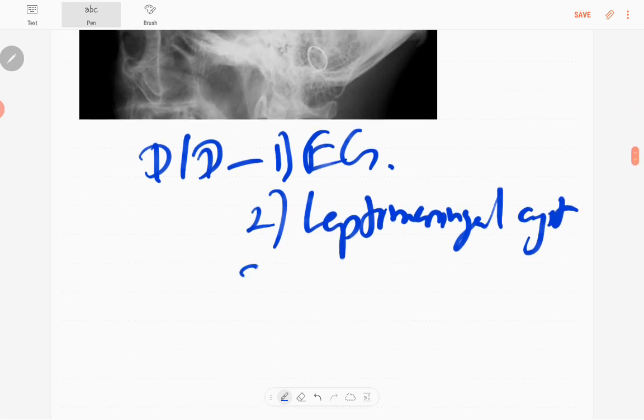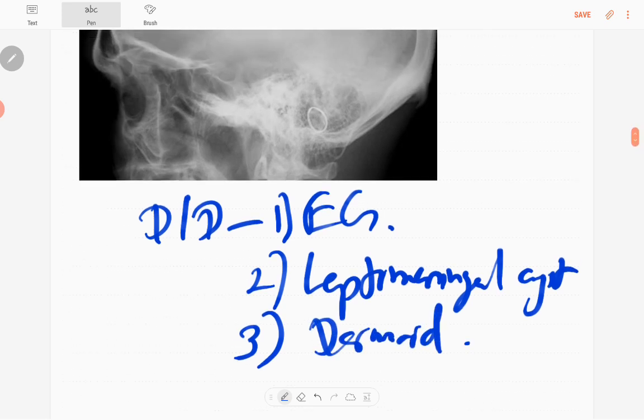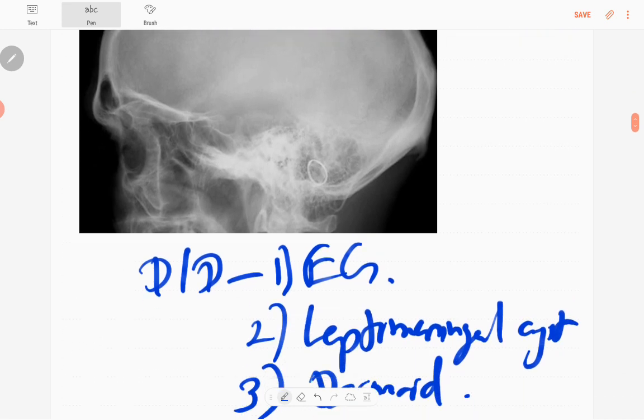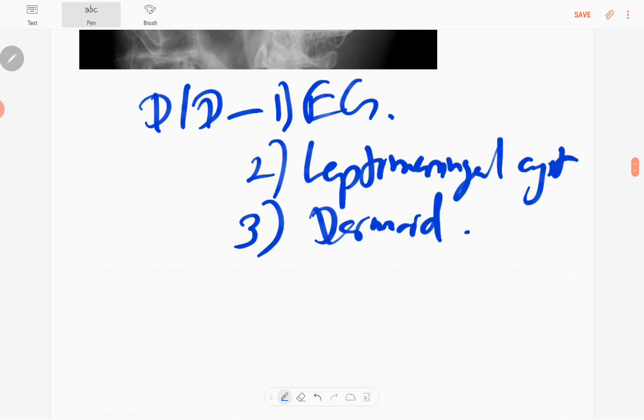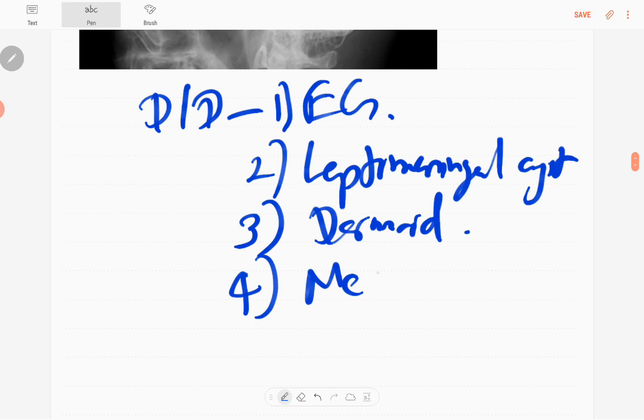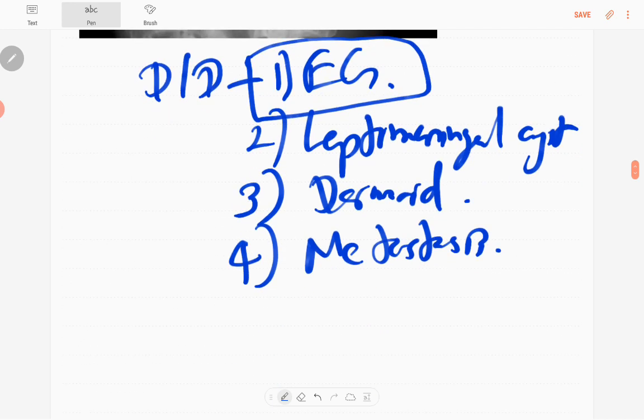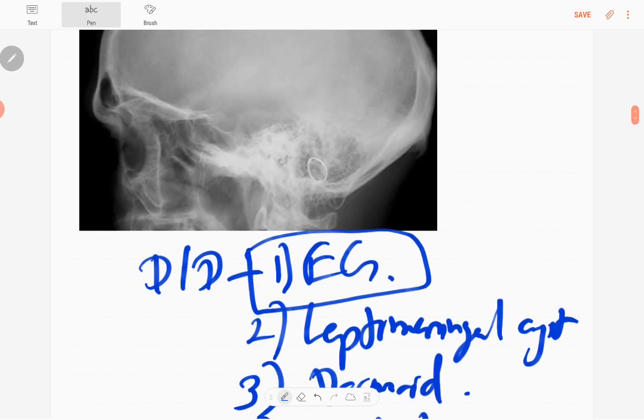And intraosseous dermoid is also another one. You can't exclude metastasis, so metastasis should be kept in your mind in a young patient. The diagnosis in this patient is eosinophilic granuloma.